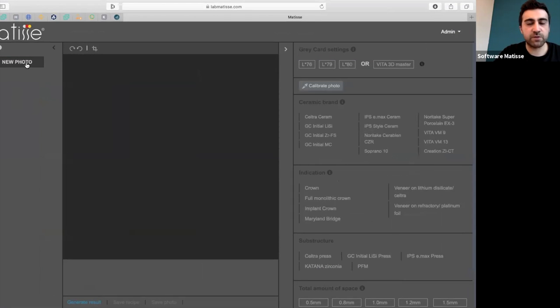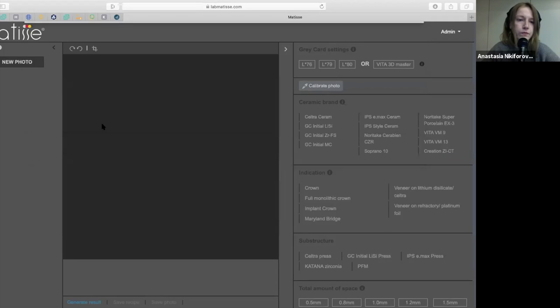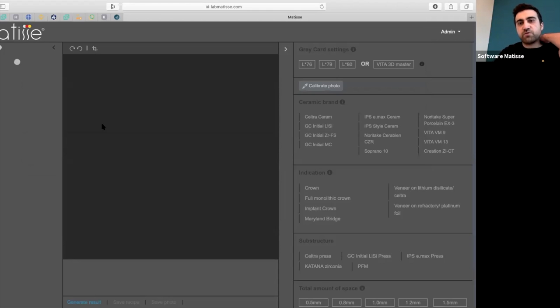So on the left side we upload our images. And we need to start the case. The most predictable way is to have three kinds of pictures.